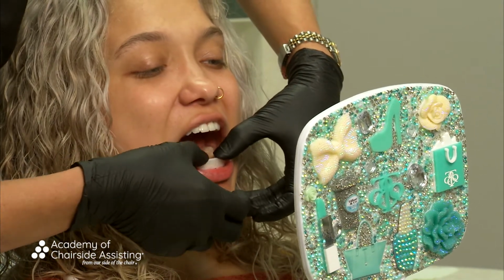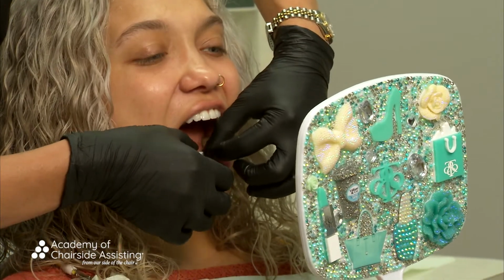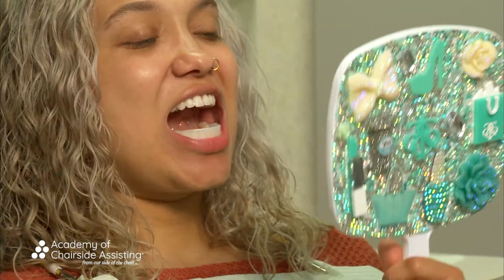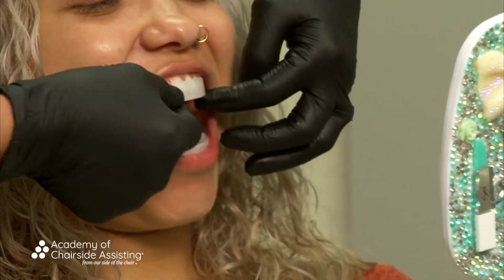And again, remember that I don't want to pinch it too hard, but I do want to pinch it enough to where I've got it stable on the teeth, okay? There we go. And then I'm going to go to the upper. I'll slide that one in.